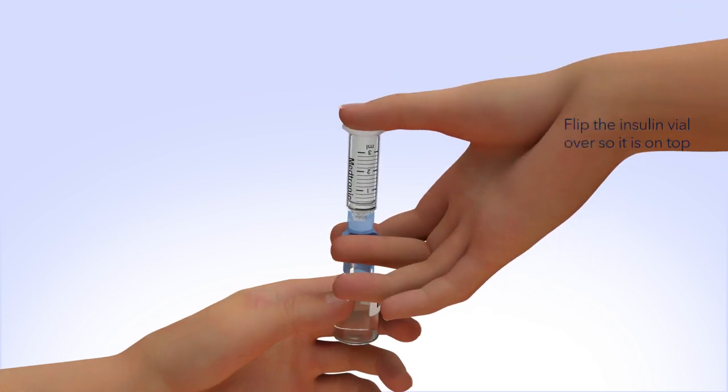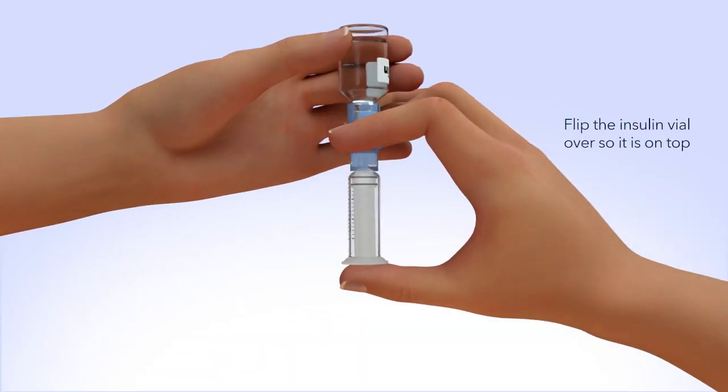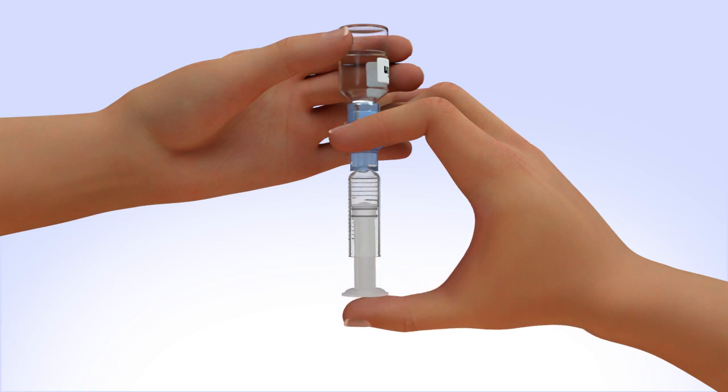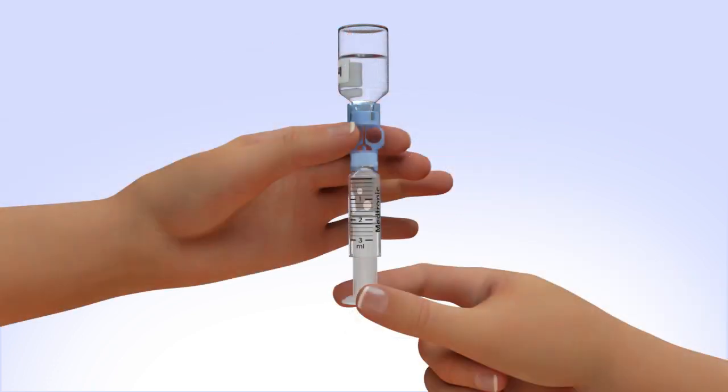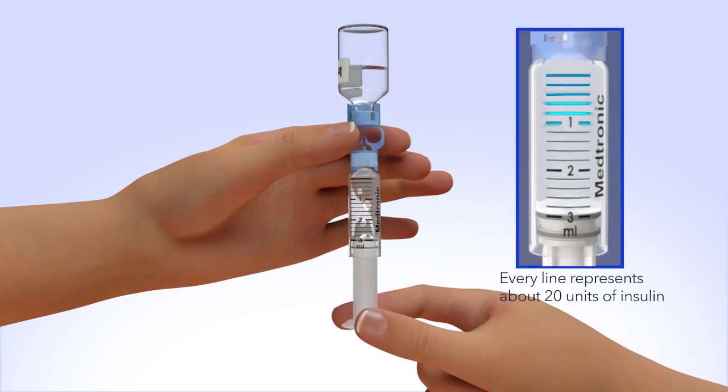Holding the plunger with your thumb, flip the insulin vial over so it is on top. Make sure you are holding the vial with your other hand. Slowly release your thumb pressure from the plunger rod and the reservoir will start filling with insulin. When the reservoir stops filling, pull down on the plunger until the top black o-ring lines up with the desired amount.